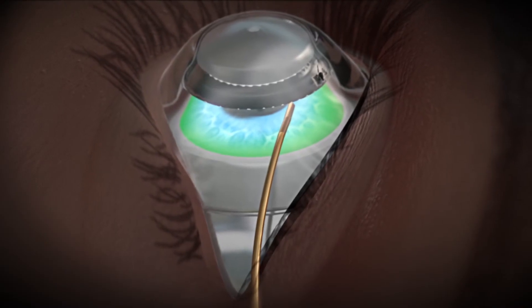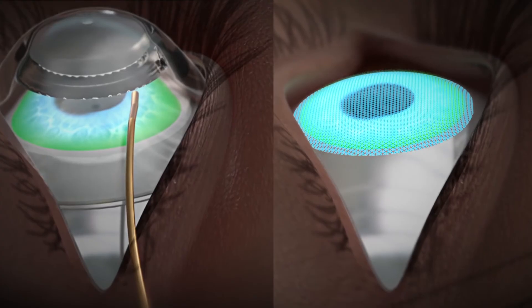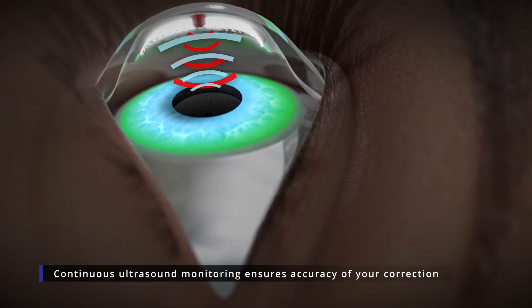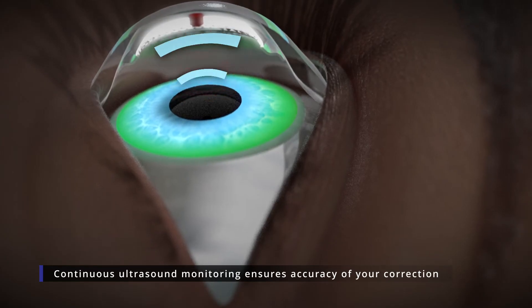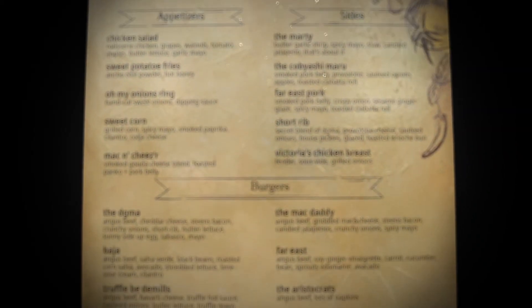The light and the vitamin work together to strengthen your cornea, causing it to take a new shape for your prescription. As your cornea strengthens, it is better able to reflect sound, so the contact lens uses ultrasound to measure this effect, ensuring an accurate prescription.